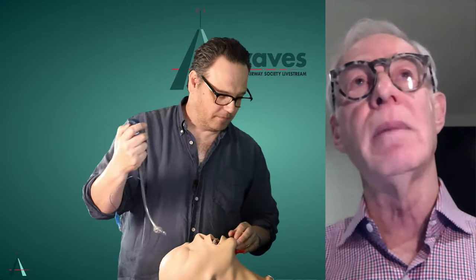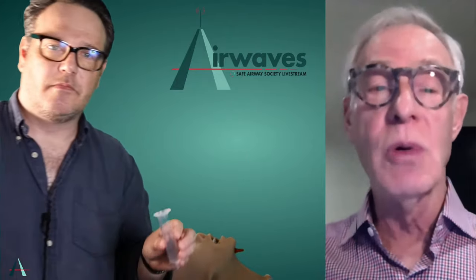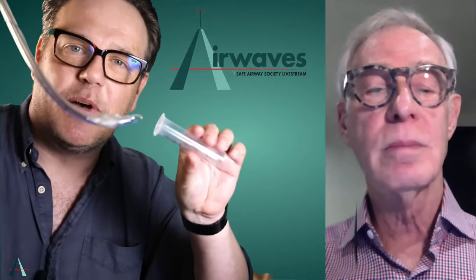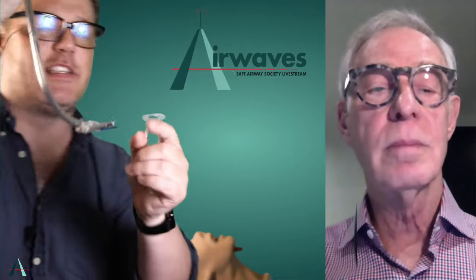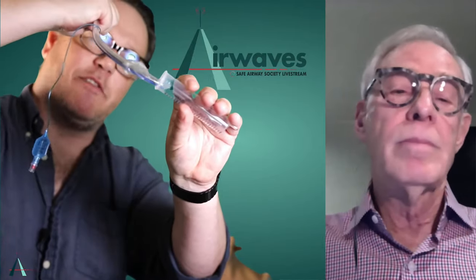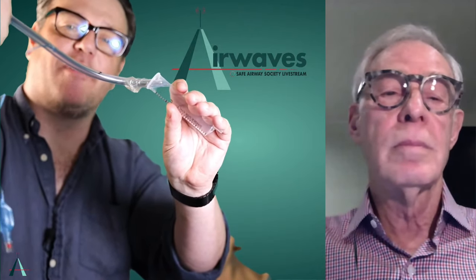Well, usually by the time you've removed the stylet, I'm thinking back into my own practice, when I have had that problem, I've turned the tube clockwise, so it is to the right. Yeah, so just to make that clear to the audience, if you look at your tube, the bevel's over here on the left, and if you're impacting on the arytenoids here, if you rotate anti-clockwise, the bevel can now clear the arytenoids. But if you're below the cords, then you need to go right because you now want that bevel at the front to clear it. So it's just a finessing point that I've found since using your technique. I haven't really needed to do much, but it's worth being aware of.